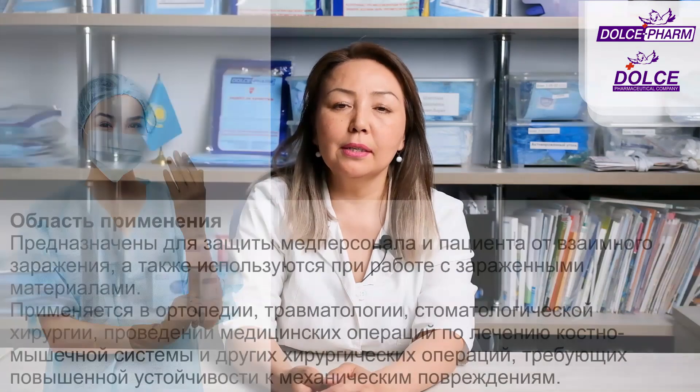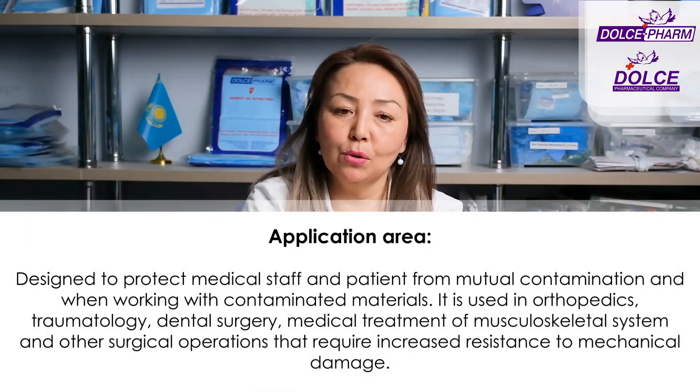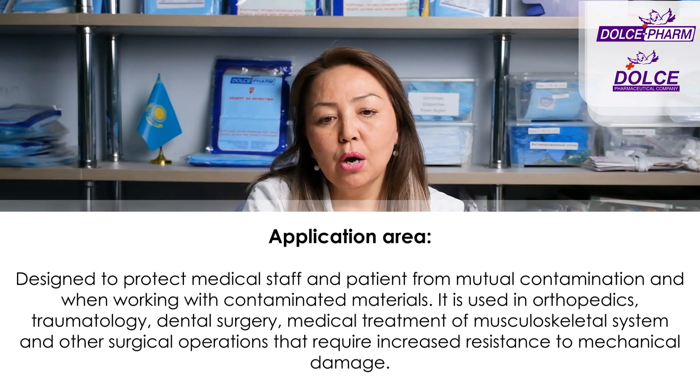Surgical Ort — orthopedic gloves — latex, smooth, non-powdered, sterile. Areas of use are in orthopedics, traumatology, dental surgery, surgeries on the musculoskeletal system, and other surgeries requiring high resistance to mechanical damage.